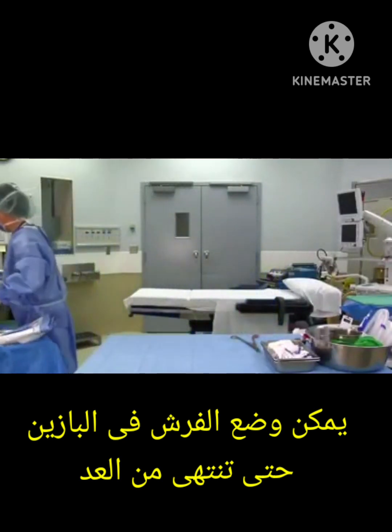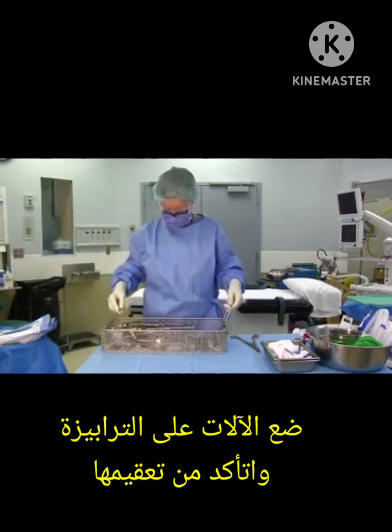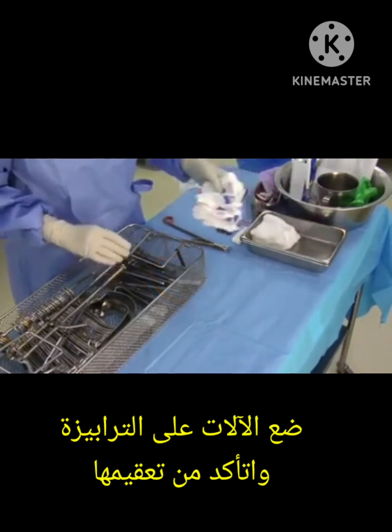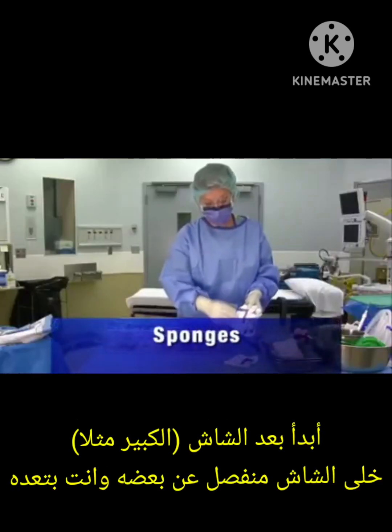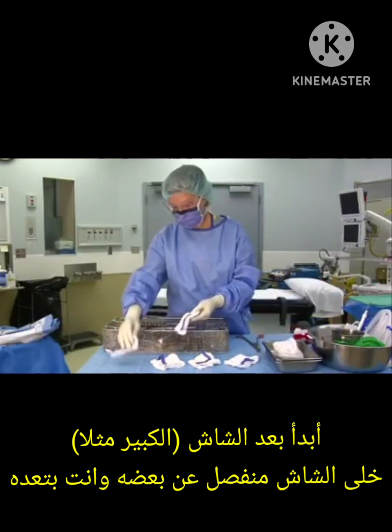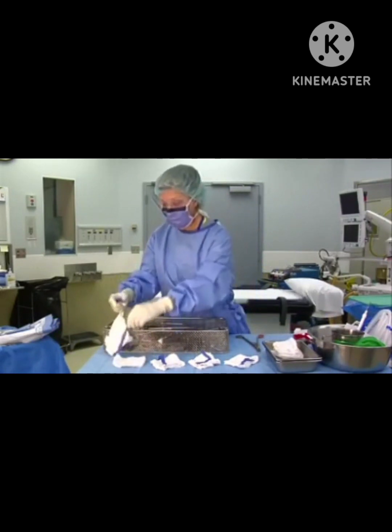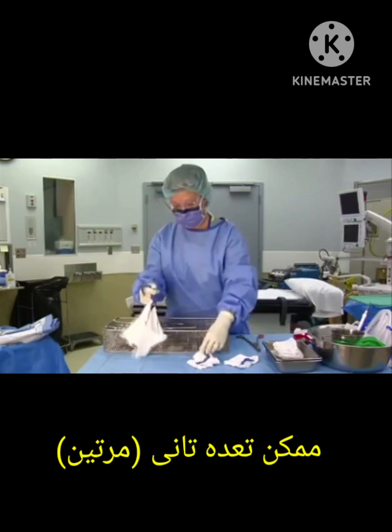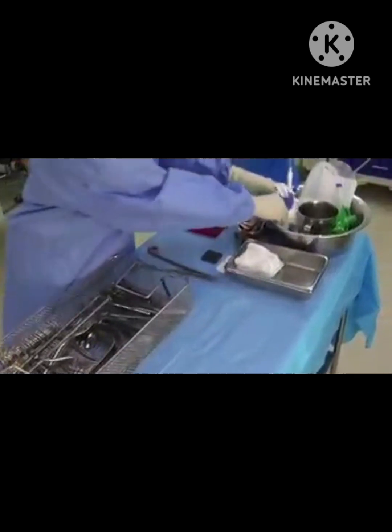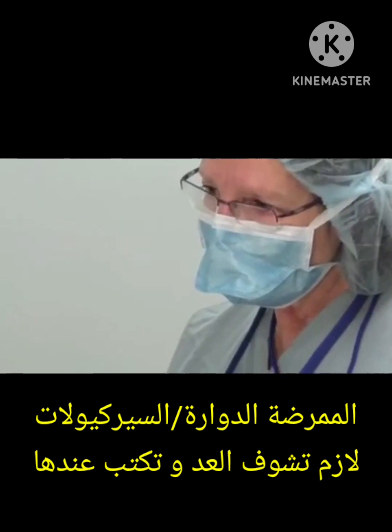Move the drapes from the working space and place them in a basin or to one side of your table. Place the instrument set where it will be used and check that the sterilization indicator is present. The count begins with sponges. Take a group of laparotomy sponges in one hand, lay each sponge separately on the table in groups of five, and keep the last sponge in your hand.